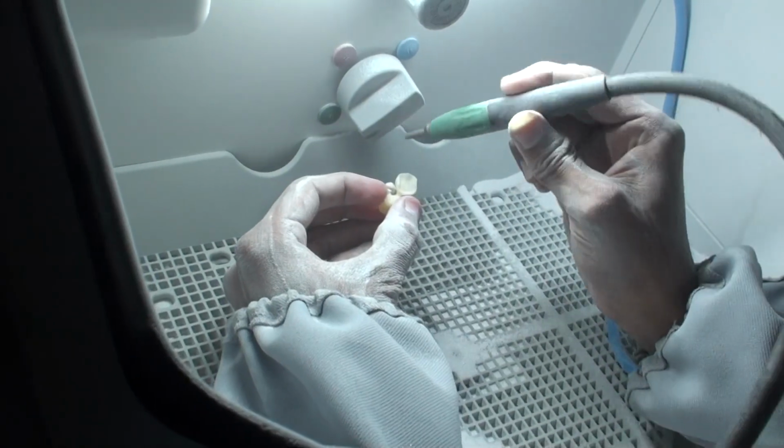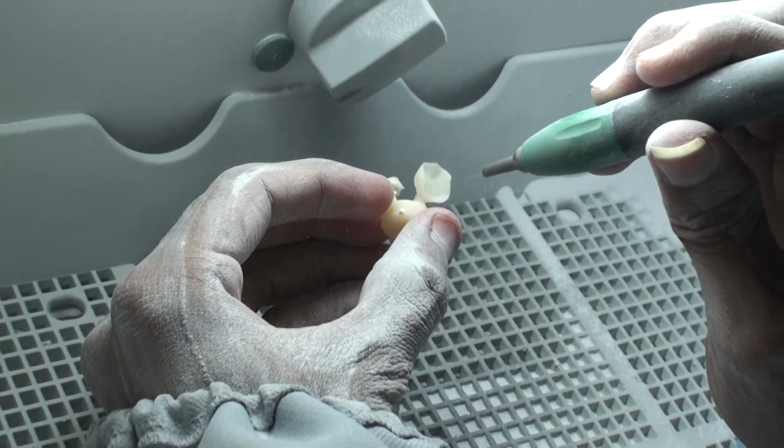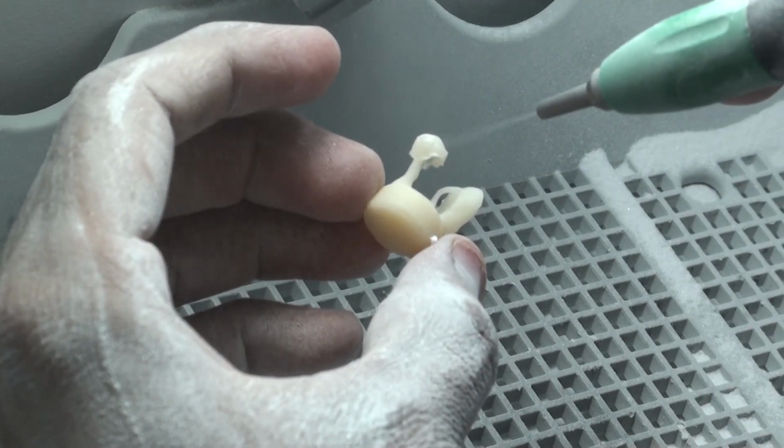Now, how do they get rid of the investment material? That's how they do it. They take it into a sandblasting unit, and you can see a little bit better there. The sand is essentially removing all the investment material, and you're starting to see the pressed material on the inside. Kind of hard to see, there's so much sand floating around everywhere. I asked him to open the window just for a quick bit. So now all the investment material is gone. He's cleaning up the final bits.